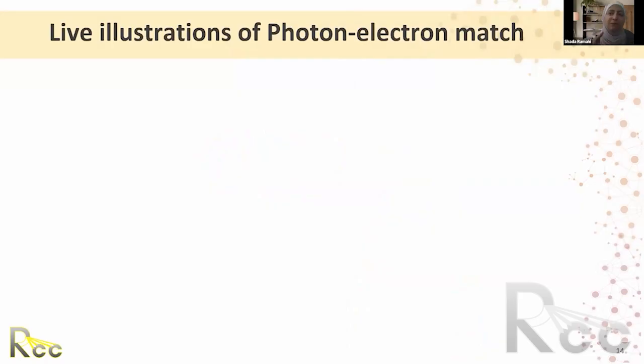All right, so now I'm going to switch and show you. And I'm doing a head and neck, parallel opposed beams, off cord, and then with electron match. I will not do the full plan. You know, I did something quick yesterday. I will show you the result, and then we'll put the match and we see what's going on.